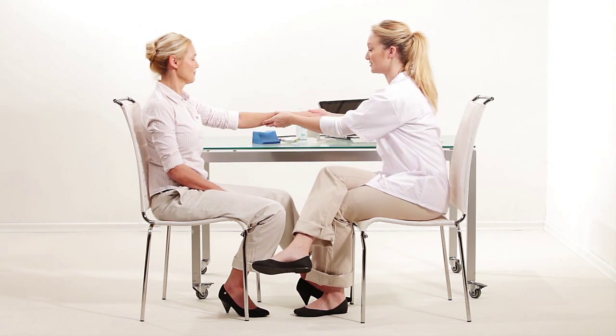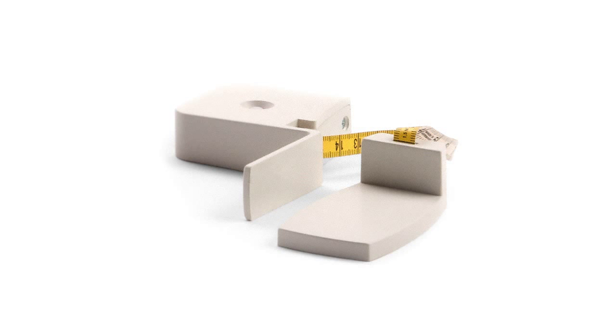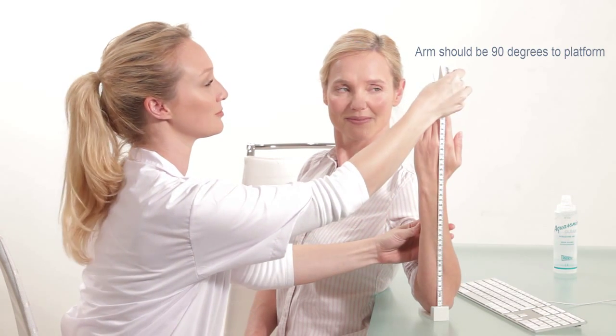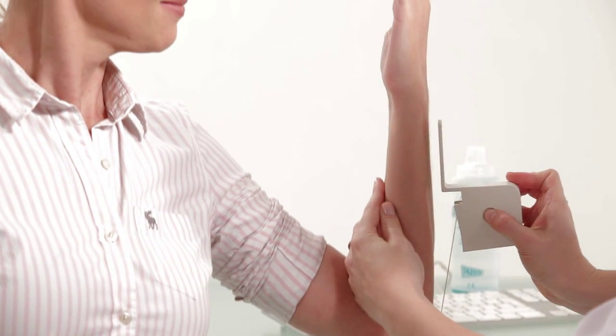To measure the radius, the subject should be seated opposite the operator and next to a standard desk. Use the gauge to determine the measurement location. Place the elbow of the subject's non-dominant arm on the gauge platform. Make sure the subject's arm is at a 90 degree angle to the platform and the palm is facing the subject.